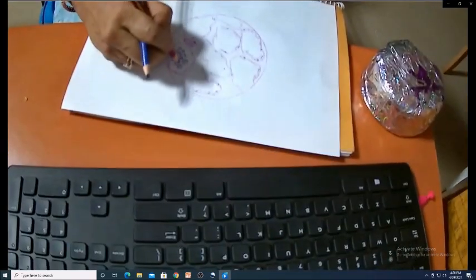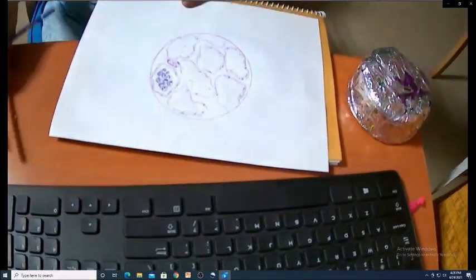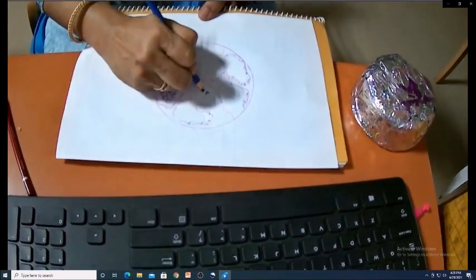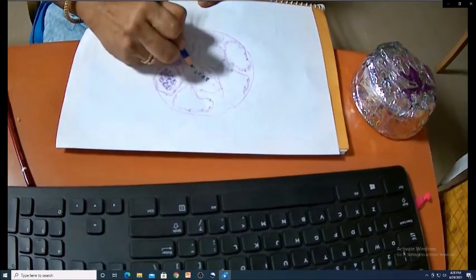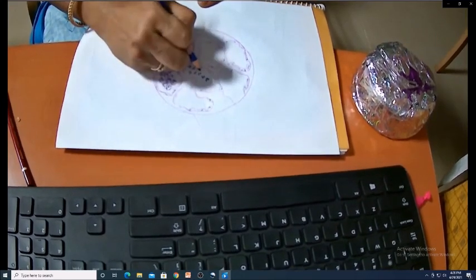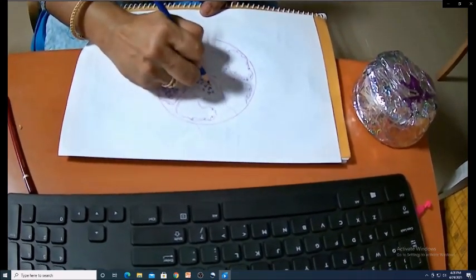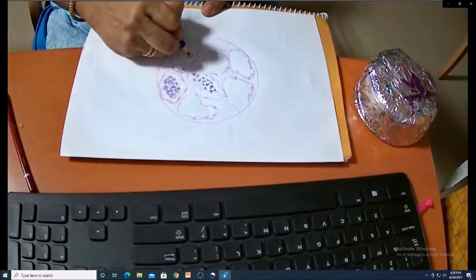Okay. So fibrin, using eosin pencil to draw or to show fibrin. And observe now, I've just written these cells and exudate only in the center, leaving a space between the exudate and the alveolar wall. Okay, now this process goes on. So take some time to draw neutrophil exudate within the alveoli. Hardly some 7 or 8 alveoli I have written in one high power.